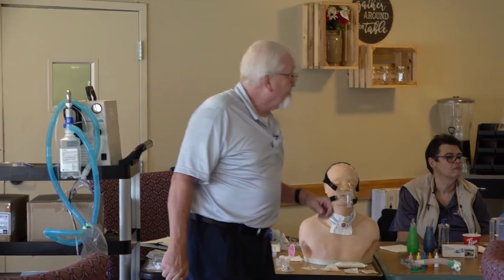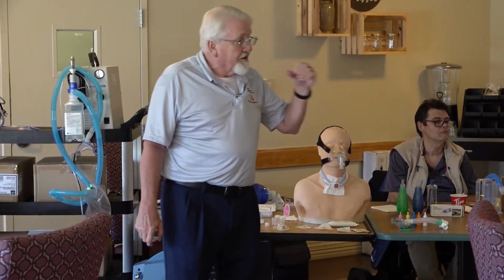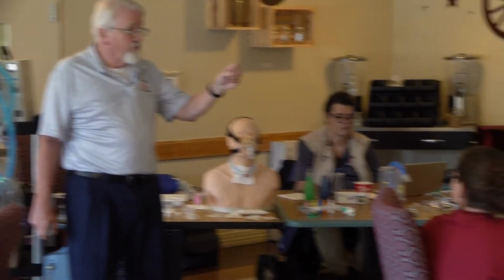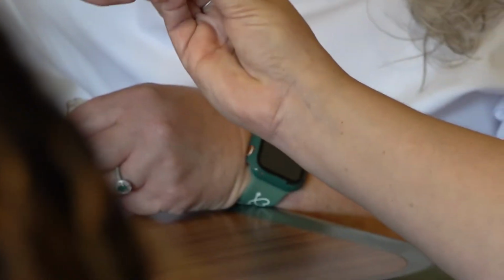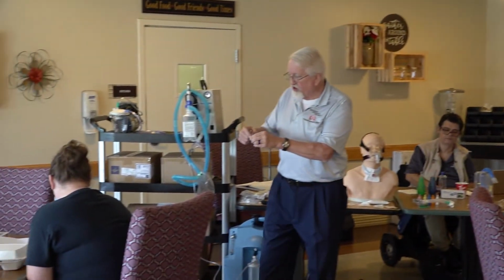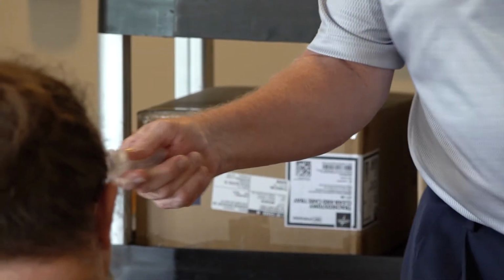So that little bit of what looked like foam in there is a hygroscopic material, which means that it absorbs moisture out of the air, and so when they exhale, any moisture will be trapped in that, so when they inhale, they're getting some of that moisture back in. You also noticed, I hope, that you can push on that, and that closes. Okay, this HME just pops right in there, like that.